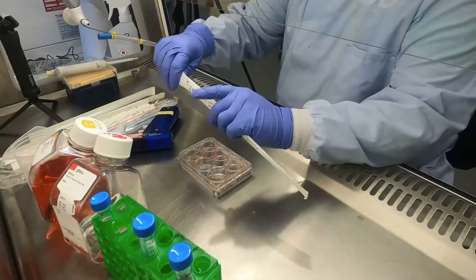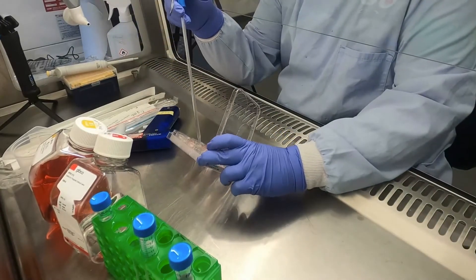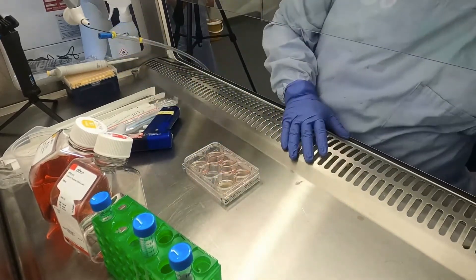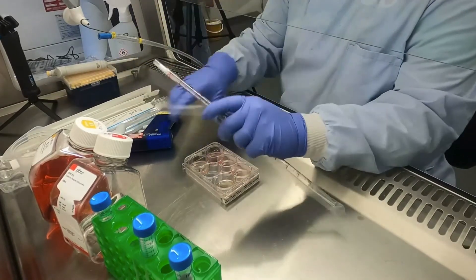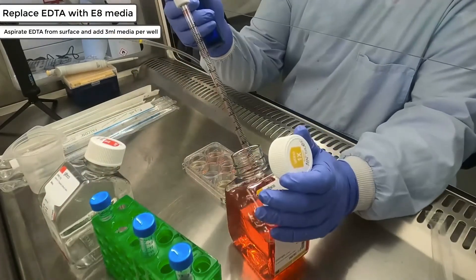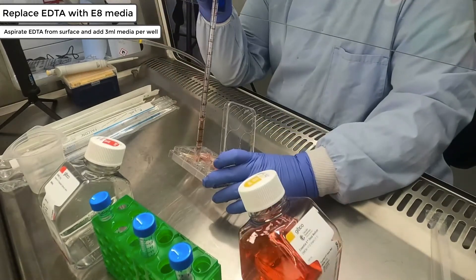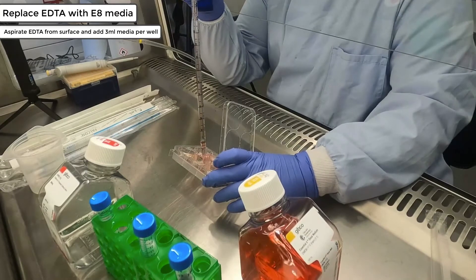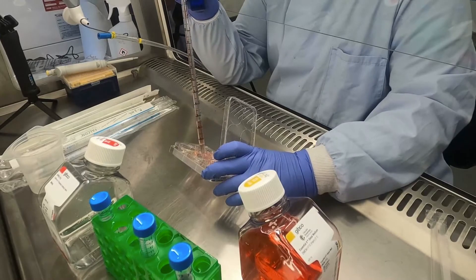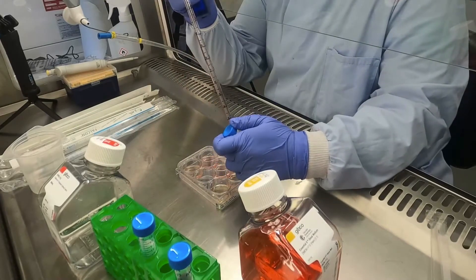After 3-5 minutes, retrieve your cells from the incubator and aspirate the EDTA from the cell surface. You should then add E8 media using a stripette, pipetting up and down to detach the cells — here we're using 3ml of E8 media. Try to avoid pipetting the cell suspension up and down more than a few times as this will cause the colonies to break up. If you struggle to detach your cells the first time, repeat the process with additional media. Then transfer the cell suspension into a falcon tube.